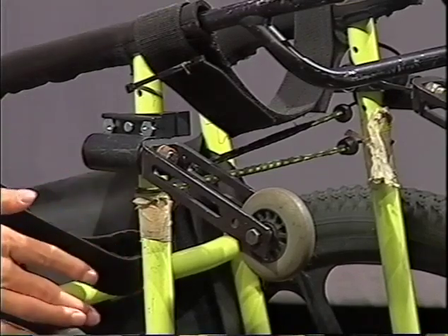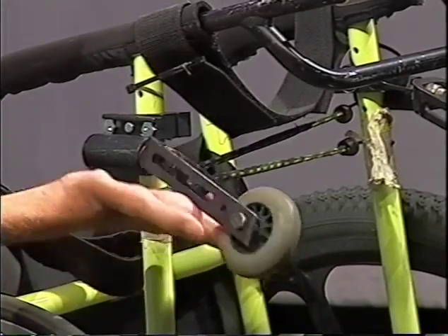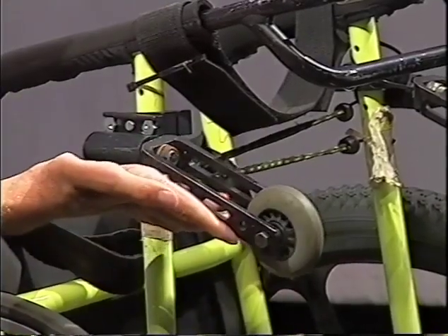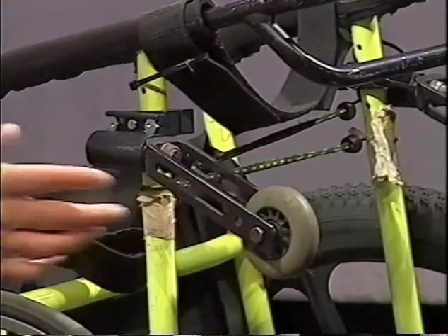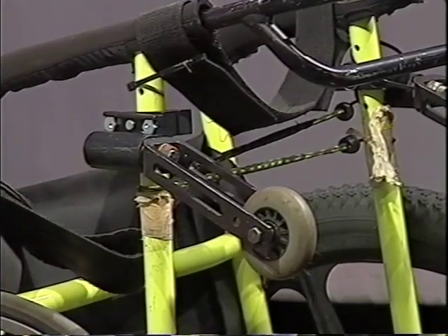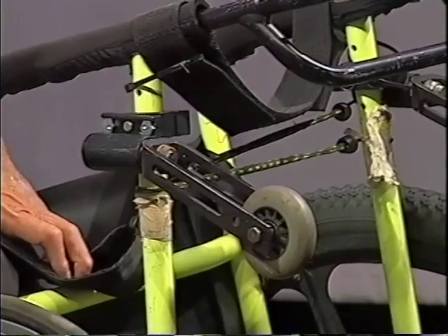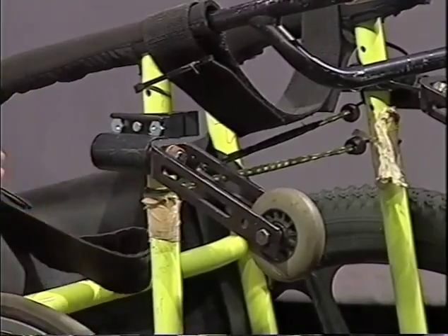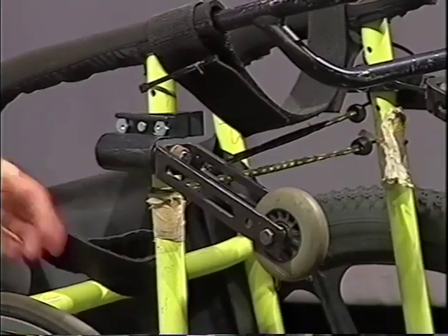This is my tennis chair, and I always have micro casters on it because they turn very easily on a smooth surface. And I'm not really expecting to run into any bumps or things like that on a tennis court. So they turn very quickly, and that's why they work well as the micro wheel.